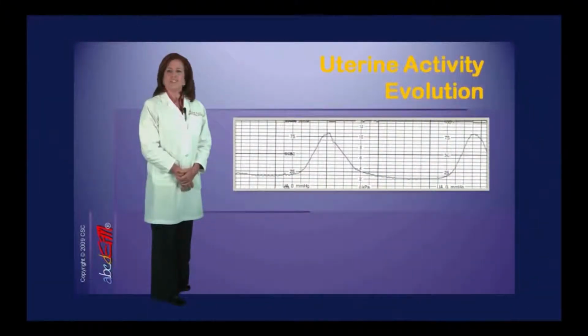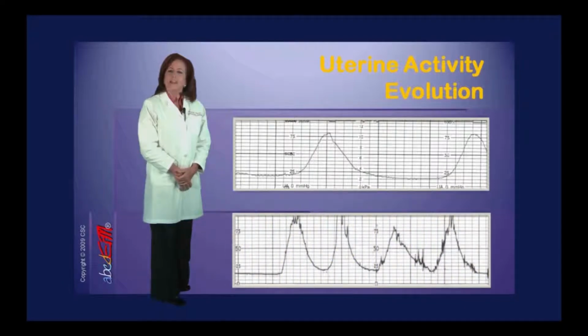The evolution of uterine activity, decelerations, and fetal heart rate patterns over time assists the perinatal team with the maternal fetal care plan. The evolution of uterine contractions into tachysystole may warrant alterations in induction medication administration.